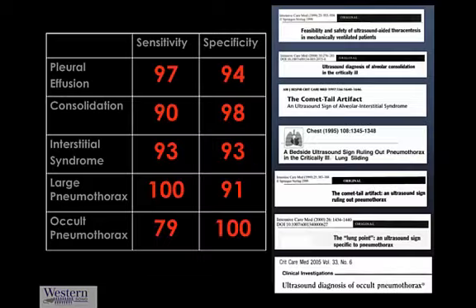With respect to its diagnostic performance, here are some very important references that we can use to derive the diagnostic performance in a variety of conditions that can cause acute respiratory failure. And you can see from the table on the left that they perform very, very well.